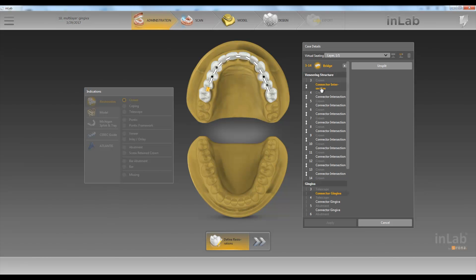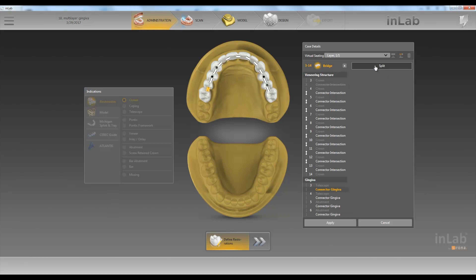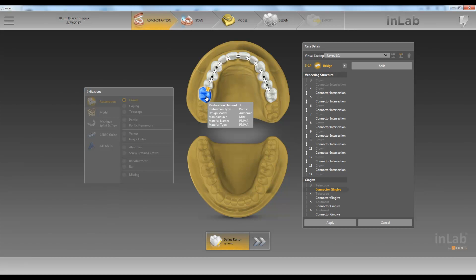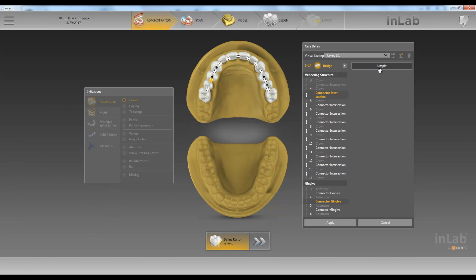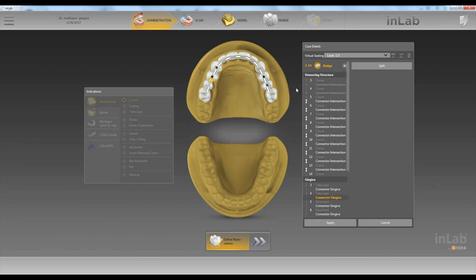And then we have an option right here called define multi-layer. Right now my bottom layer is going to be one material and the top layer is going to be a bridge that fits on top.